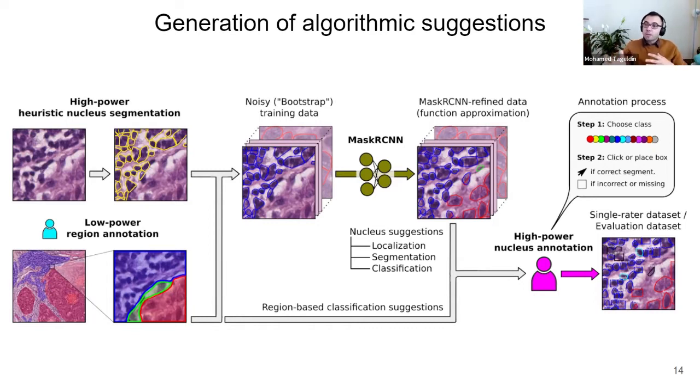For example, we can have a stromal area with some lymphocytes. You can have some cancer cells that are wandering around, and lymphocytes are scattered a lot in stromal areas, not only in areas which the participants in the previous low power view considered a collection, or a sea of lymphocytes, right? You can have individual ones that are floating on their own. But we thought this was a pretty good way to initialize the classification of the nuclei. So now we have the segmentations, and we have the classifications just by region membership.